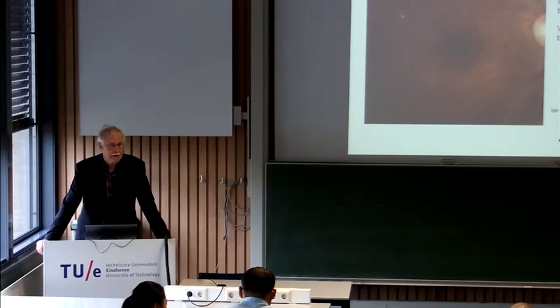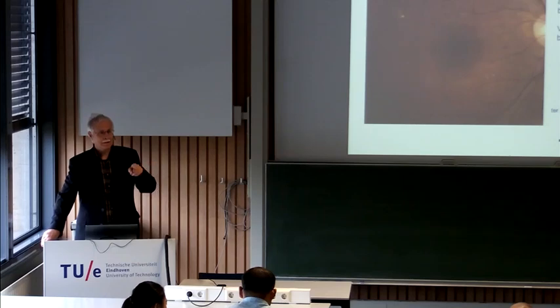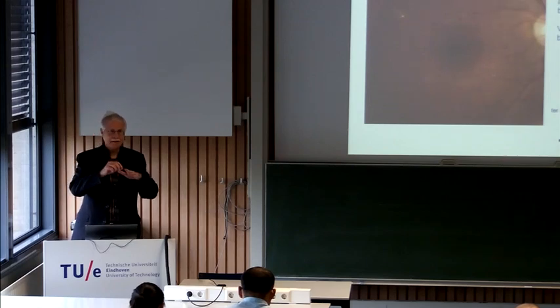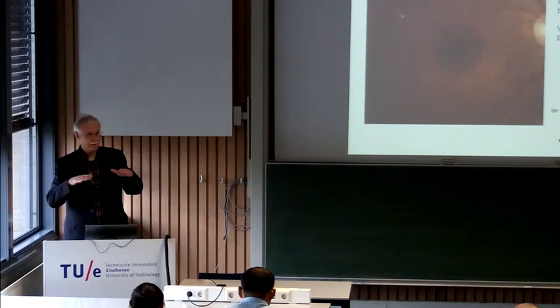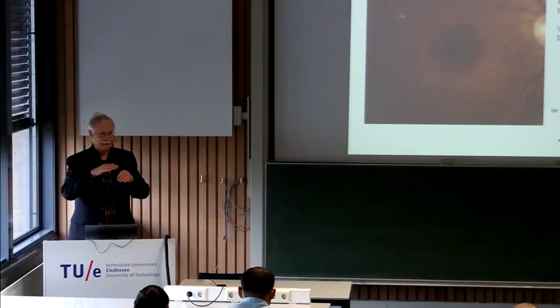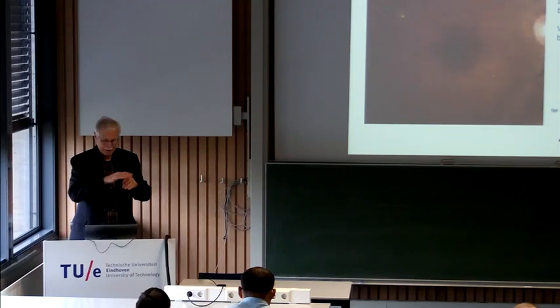It would be better if you fill up the places where you have removed the vessels with the same texture. Well, you can do that. It's a fourth-order polynomial extrapolation technique. You can see what the neighboring texture is, what the texture is on the place next door. You know what the texture is because we have all these Gaussian derivatives to very high order. So we know the Taylor expansion to very high order, describing the little structure of my background right there. That structure you can copy and say, okay, then we put that in the vessel.